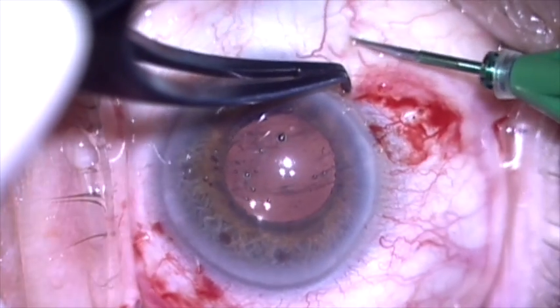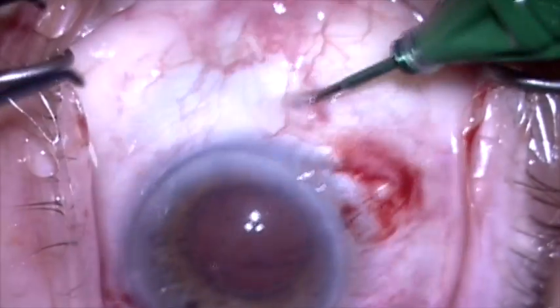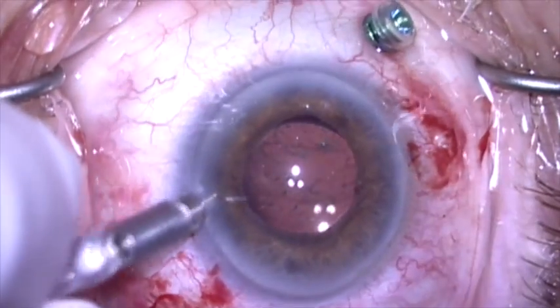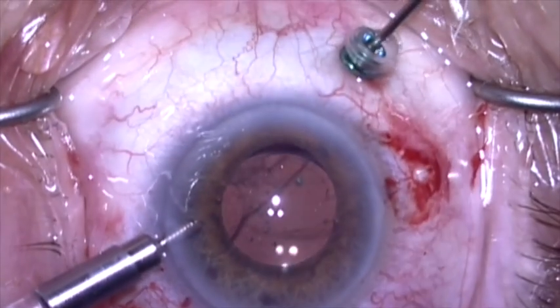We're now going to do a pars plana vitrectomy because at the beginning of the case, as you recall, there was vitreous in the anterior chamber that I displaced with viscoelastic. I'm concerned that when I remove the viscoelastic I will get into the vitreous, so we're going to clean this up a bit.